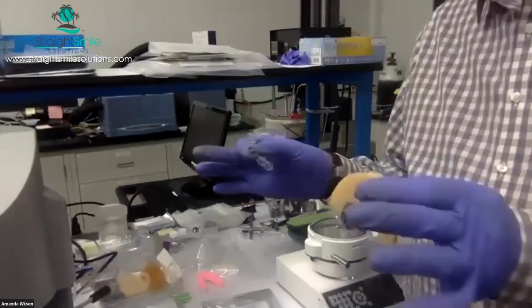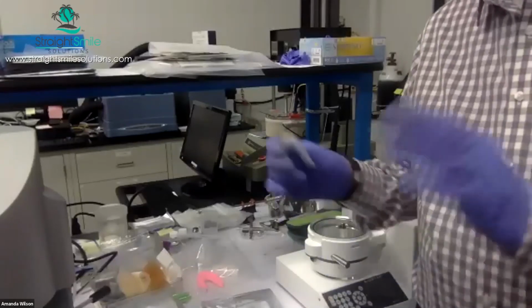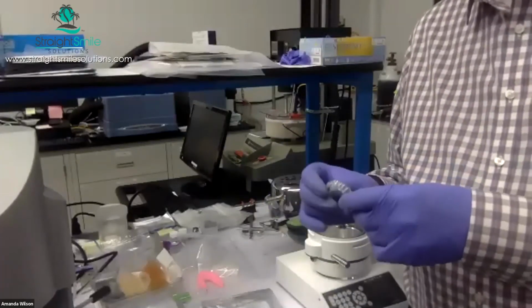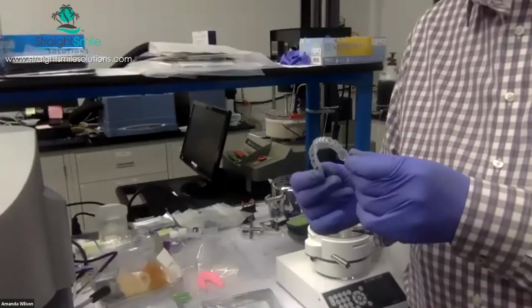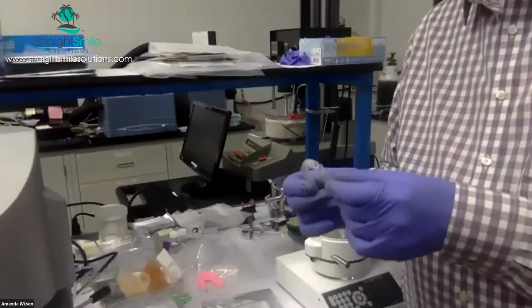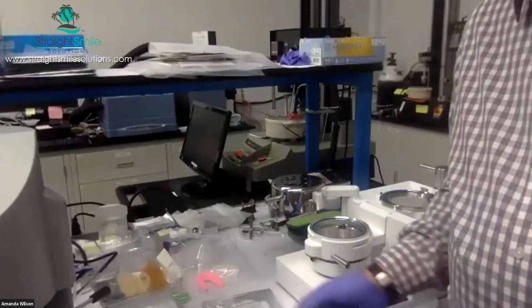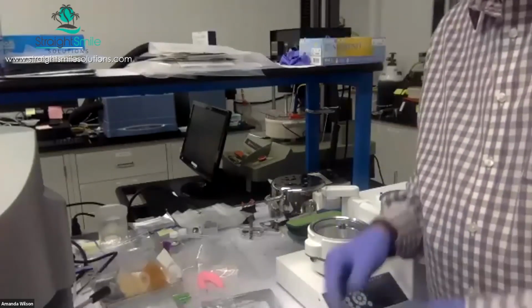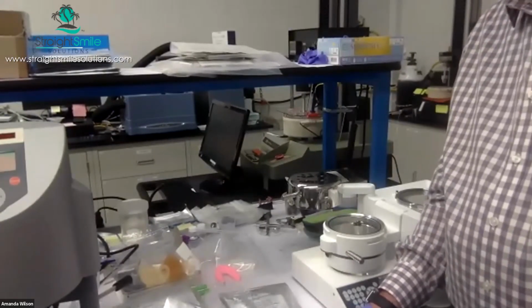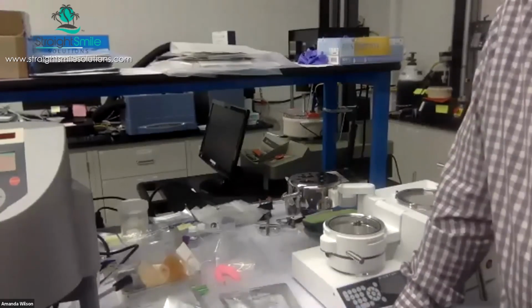But it varies very widely. There are a lot of clinicians who prefer the scallop. A lot of patients prefer that. That's what they see on the internet, and that's what they expect. But I think it's simpler for your production, as well as improving the actual product, to leave a straighter line rather than scallop. And from personal experience in the direct-to-consumer industry, there are 500,000 aligners that have been produced with straight line trim and no attachments. Assuming you have a great treatment plan and great compliance and great production, it's totally possible to do this, and you'll save a lot of time.